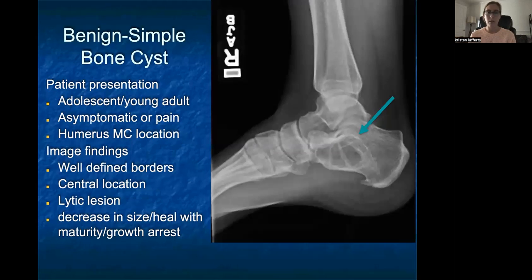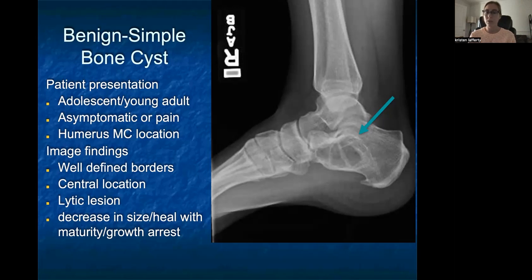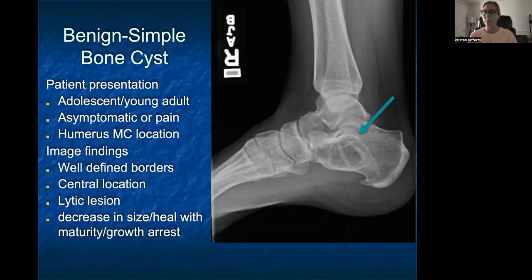Simple bone cysts are the second benign lesion. Patients are generally on the younger side — adolescents or young adults — and generally asymptomatic, though some may have pain with larger lesions. The most common location is actually in the humerus. Radiographic findings include well-defined borders and a centralized location within the bone. These are also lytic lesions with a grayer or darker appearance. They do not usually have as well-defined sclerotic borders as non-ossifying fibromas, but they have a benign appearance with no periosteal reaction, no mixed lytic and sclerotic lesions — a bubbly appearance which is usually benign.